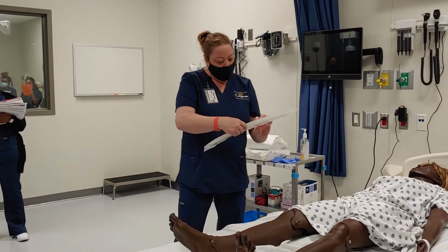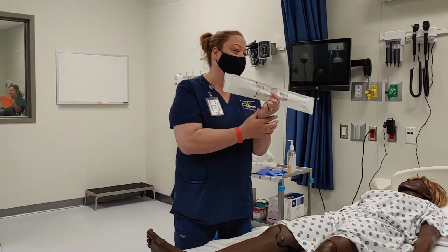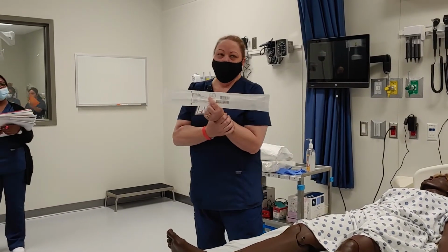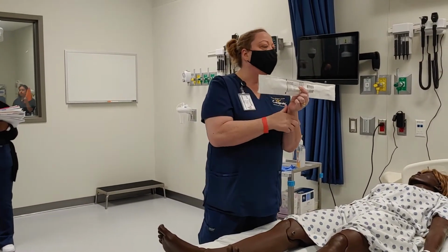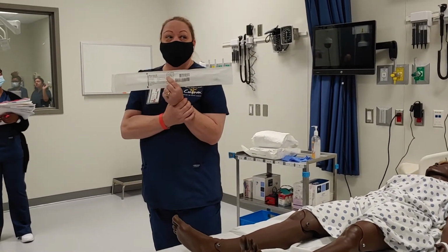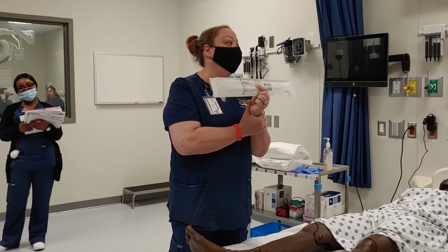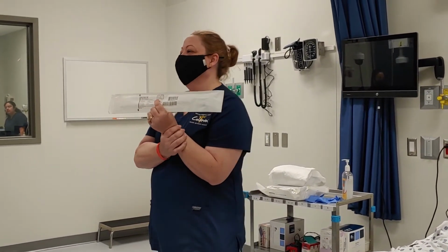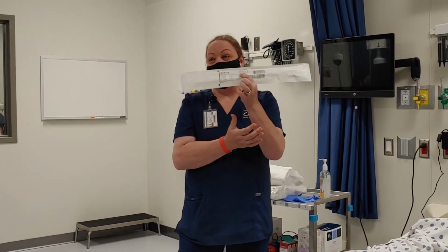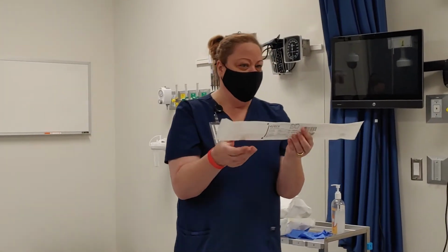And then this one here is actually a 24 French, so this is a large one. Now, would you think that on a male we would be using a larger French or a smaller? Smaller. For a male, it goes inside their... They have a larger urinary opening than we women do. So men actually are going to have a larger one. Okay? So it kind of sounds backwards, I know.